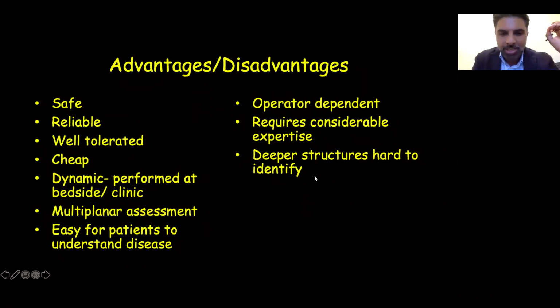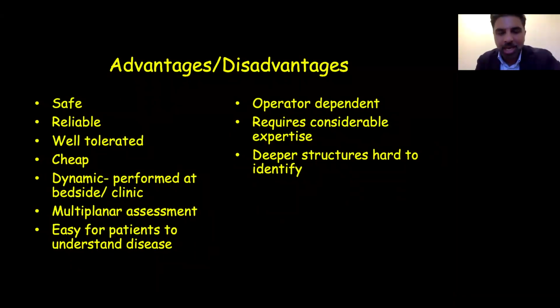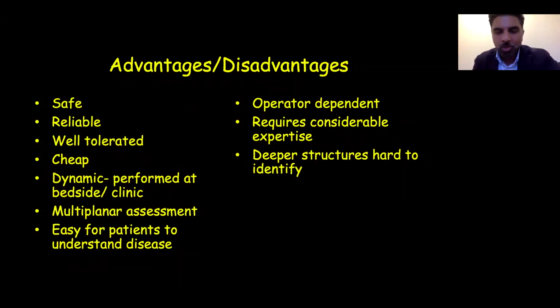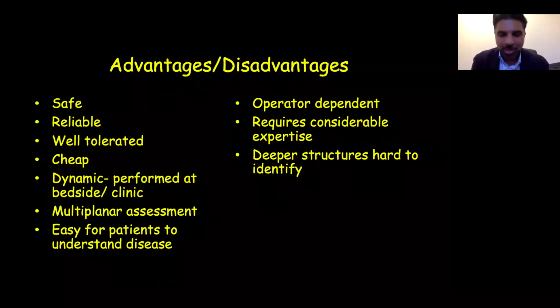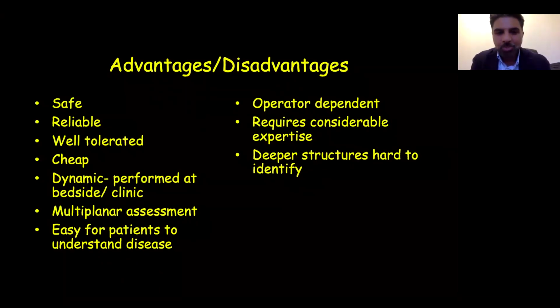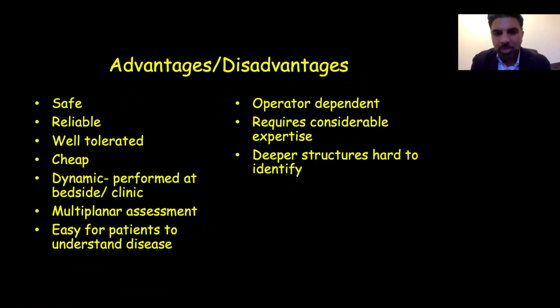I have trainees with me who spend a year learning ultrasound, and even then, they need a lot more time to develop competencies. So my recommendation always is that if you are learning ultrasound, learn from the right people, and make sure you go for some sort of accreditation, especially with a niche specialty like rheumatology.